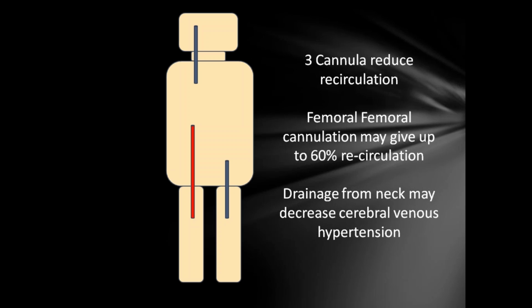returning cannula. So what you need to do is, the one you are using for drainage, push it a bit inside to the RA and use it as a return. Use this jugular cannula which you are using for return now, use it for drainage, and put an additional cannula in the femoral vein, and that also you use for drainage. That would be the ideal thing.